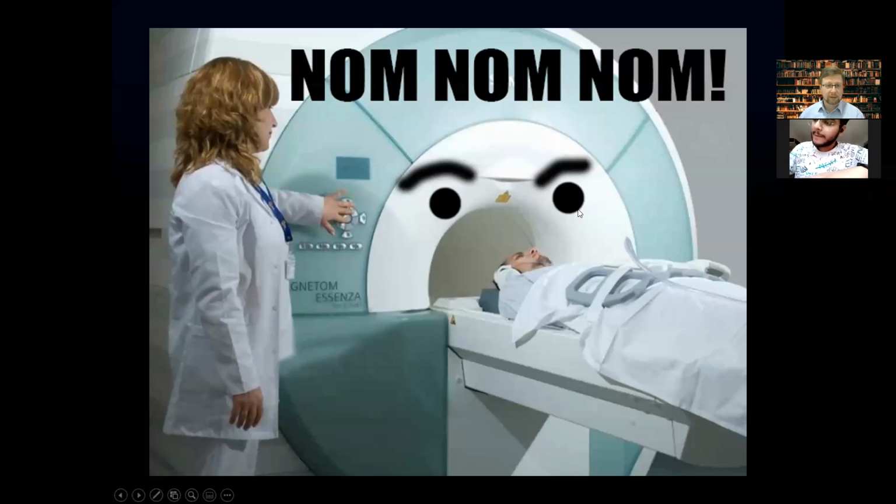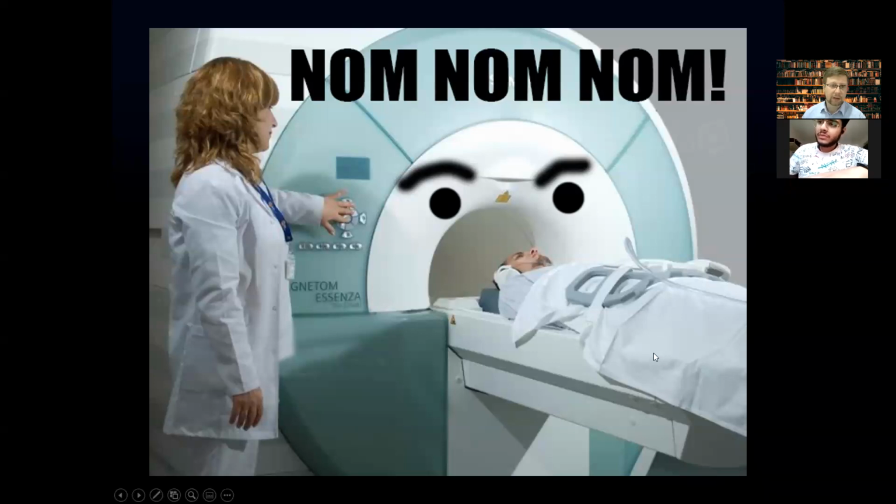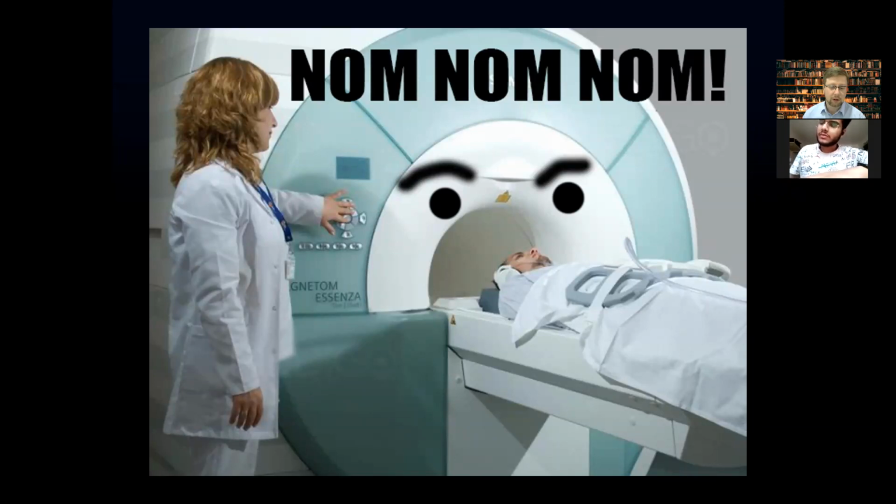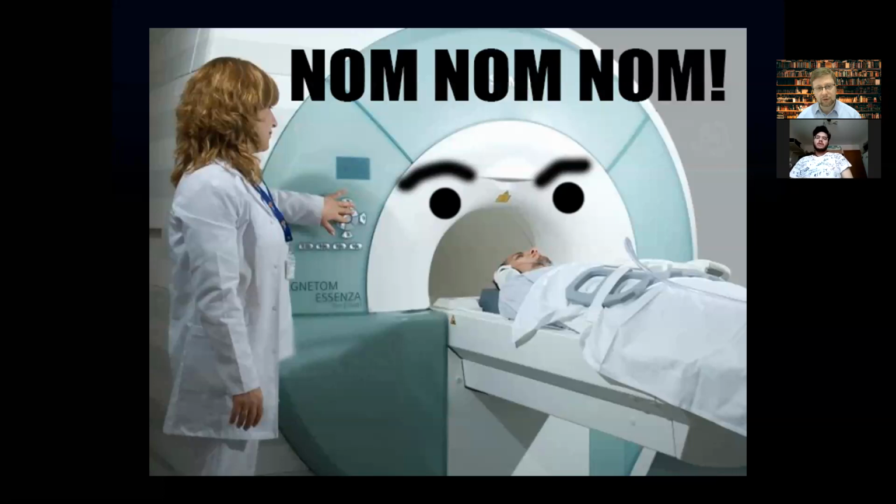So it's such a funny image, but actually it's not always funny for the patient, because this is a magnetic resonance imaging device. Some patients have claustrophobia, and it's not always possible to perform X-ray, CT, or especially MRI imaging without any problem, because the MRI gantry is deeper and bigger, and in some patients we must perform sedation before performing magnetic resonance imaging.